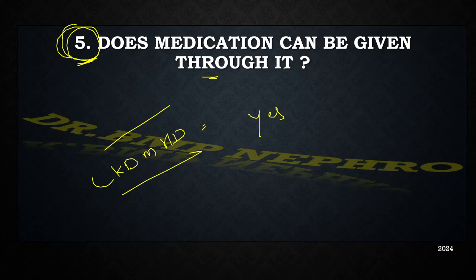because we have seen cases where the permacath is used to give infusions of an antibiotic. The sister or the paramedic staff might not have noticed the importance of this. They might have just flushed it and left it. The next day, there might be a clot inside. So you have to inform the paramedic or the nursing staff that the antibiotic with heparin lock solution has to be given in this permacath compulsorily to save it.